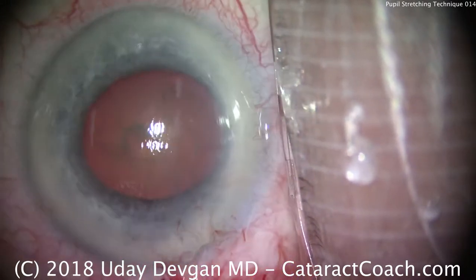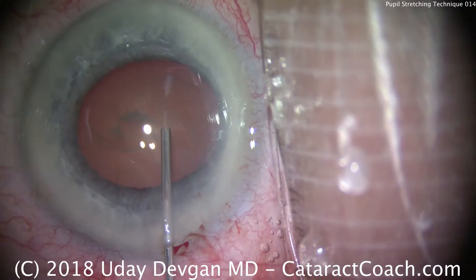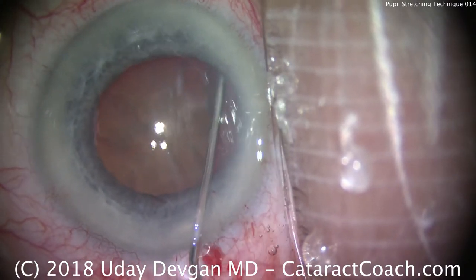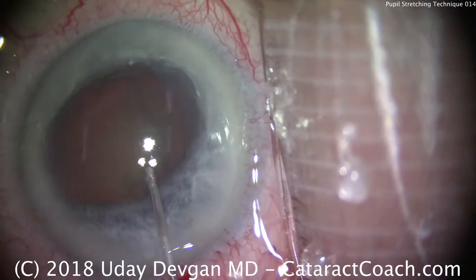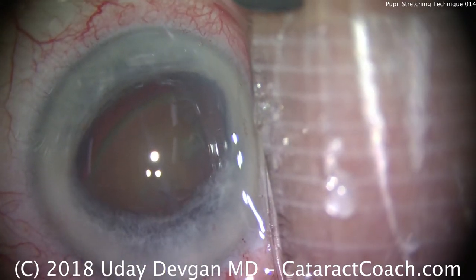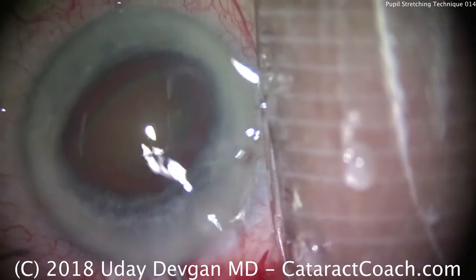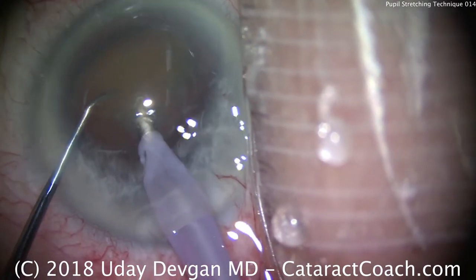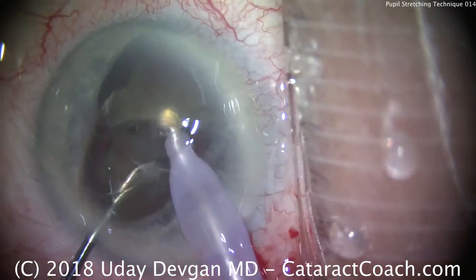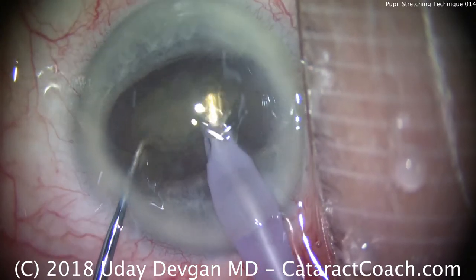We're going to do hydrodissection. Of course, we separate the nucleus from the capsule, but we'll also lose viscoelastic. So, since I know I'll lose viscoelastic, let's try to get the nucleus out of the bag using the 27-gauge cannula from the BSS to help bring the nucleus up into the anterior chamber. With the nucleus in the anterior chamber, we're now going to use the phacoprobe and chopper — buzz into the nucleus, chopper around the backside, and get two halves. We're using the cataract itself to hold the pupil open, to hold the iris at bay. Particularly helpful in a Flomax case, where the floppy iris is held in place by the cataract nucleus itself.